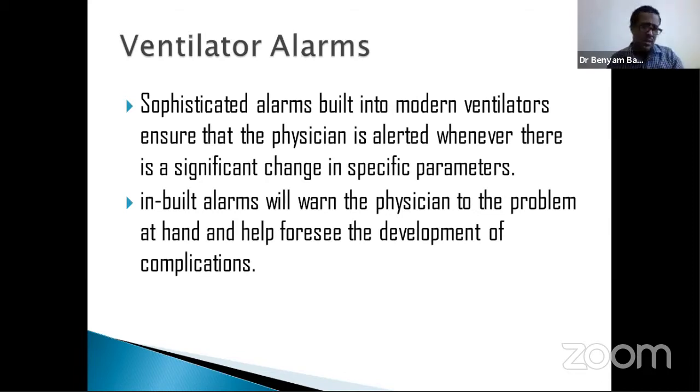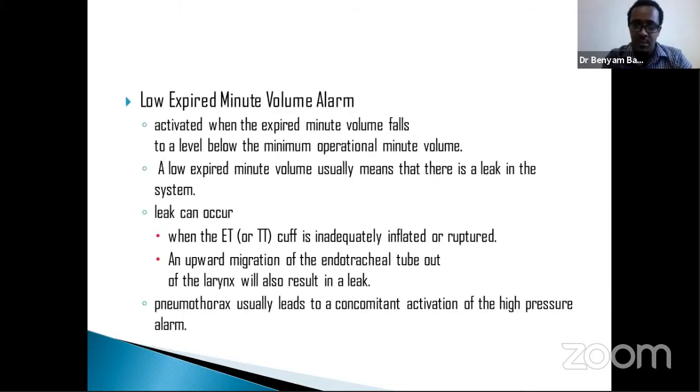most common ventilator alarms. Sophisticated alarms are built into modern ventilators to ensure that the physician is alerted whenever there is a significant change in specific parameters, or they foresee the development of complications, and the physician will be able to act on that. So I will discuss the common alarms that we face whenever we are using a mechanical ventilator.